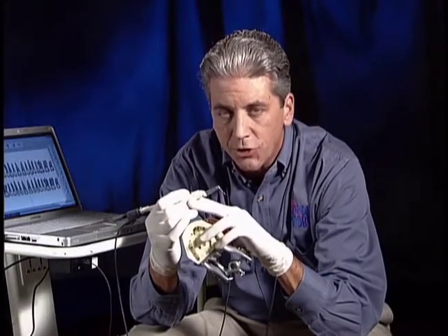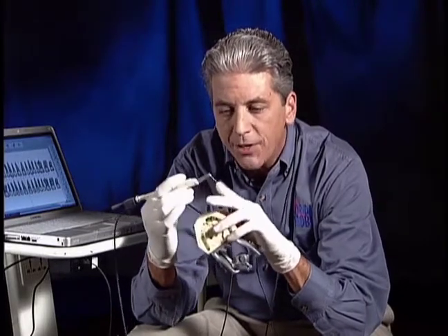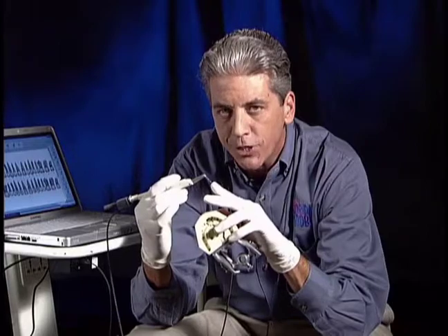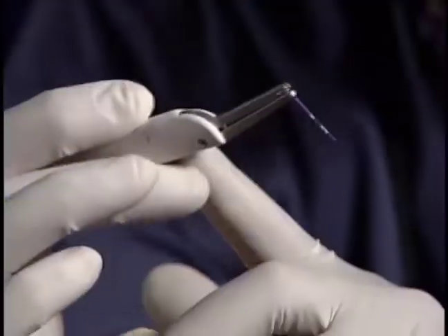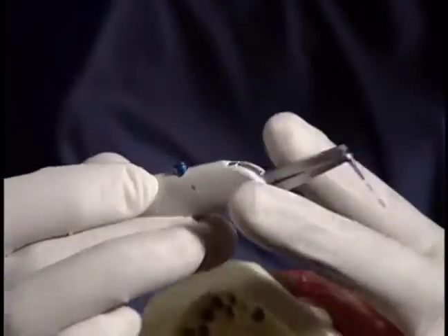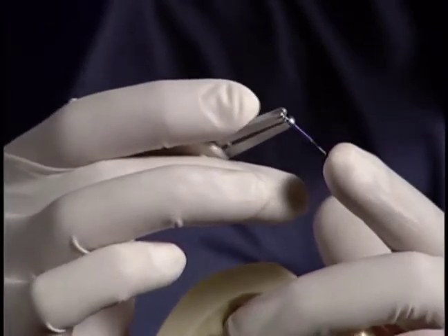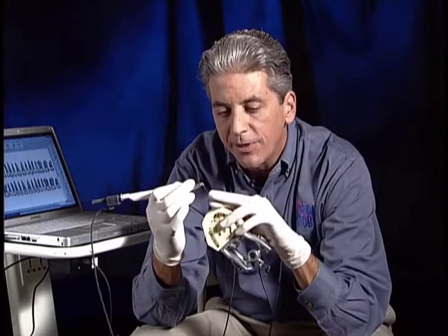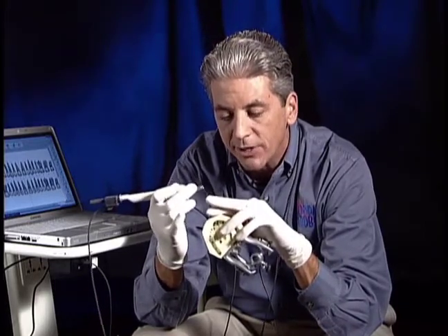So if there is a subgingival calculus, a crown margin, or some other tooth anomaly that you need additional tactile feel, it's there to override the 15 grams, make it a traditional probe so you can bypass that calculus ledge, crown margin, etc. Similarly, I don't want to interfere with the travel of that silver arm. I can't fulcrum out on the end of this probe. If I am interfering with the travel of that arm, I'm poking the patient severely.